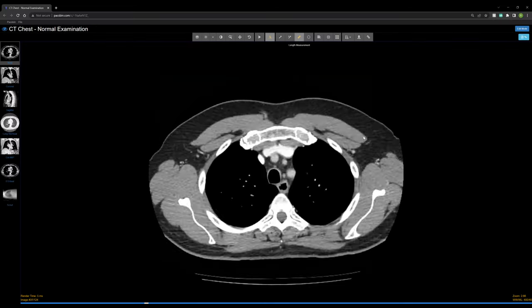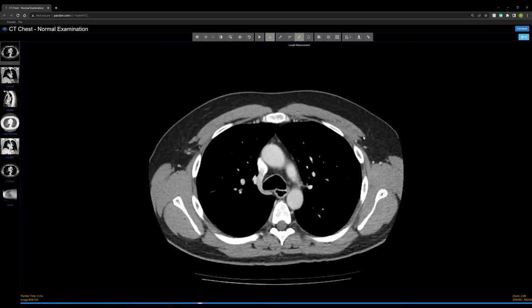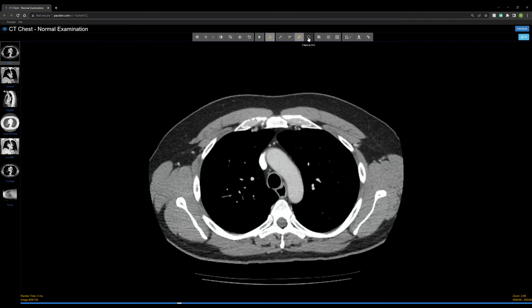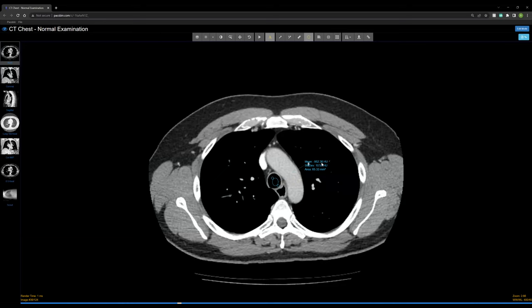Let's apply those Hounsfield units on a real CT chest. Using the ROI or region of interest tool — that little circle you'll see on any PACS or EPIC system — if you place it on the trachea, you'll see the mean density displayed in HU. The trachea reads about negative 952 HU, which checks out — gas is by convention around negative 1,000. The lungs also show up as very negative, around negative 843 Hounsfield units.